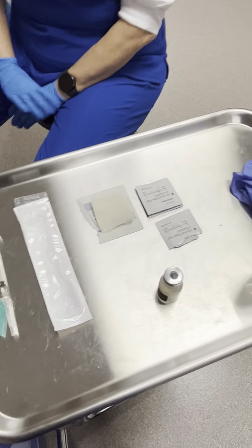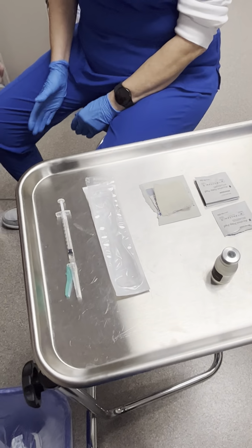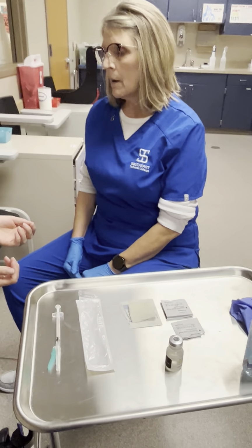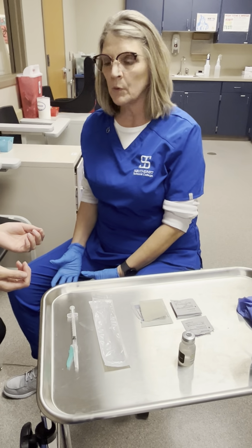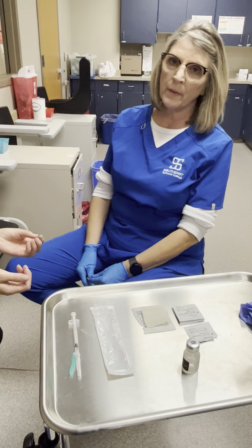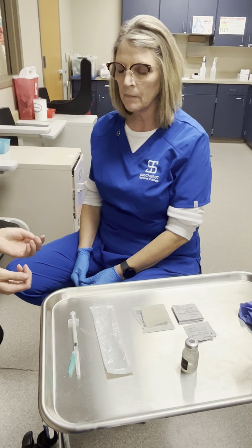One of the first steps that you want to do with this injection or any injection is to make sure that you have patient identifiers, their name and date of birth, and that you're giving the proper medication to the proper patient.